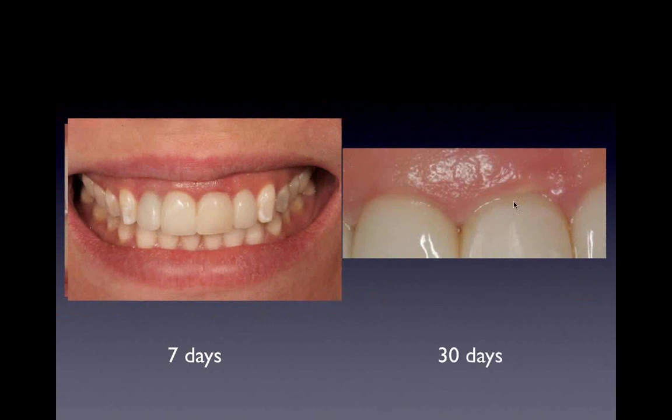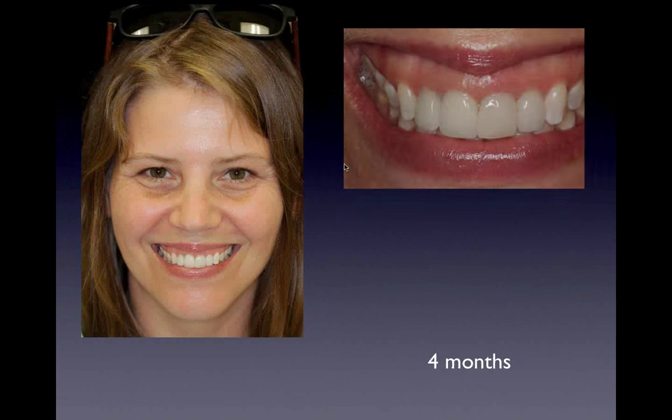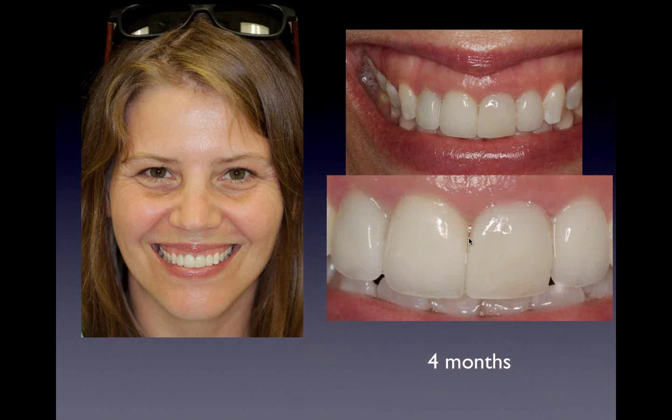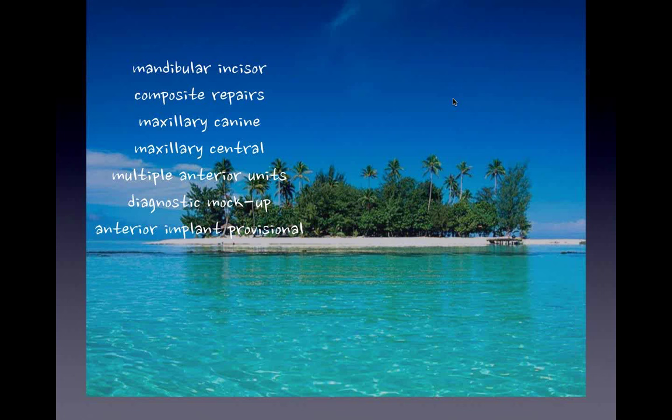And that's 30 days later. See the tissue responding there. And that's 4 months later when we did our final result. That's the provisional 4 months later. You still see the provisional there. The tissue's healed really nicely. And that's the final crown that we combined. So these composites really work well finalizing the patient's aesthetics to be able to get it to where we want.